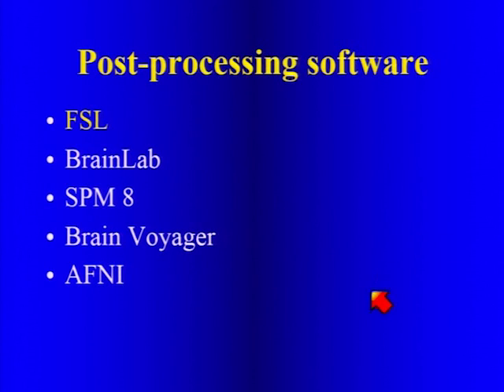You can do either. And so just like my predecessor, as opposed to having a homegrown process, we use FSL. That's freeware. It's available on the web. It's a download. There's not a lot of instructions with it, but it is what we've used, and it's very robust, and it allows post-processing in many different ways.